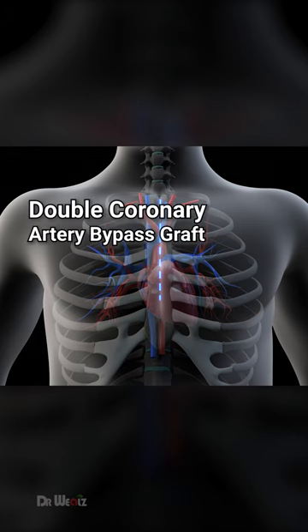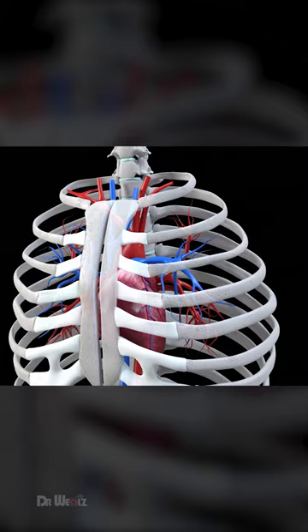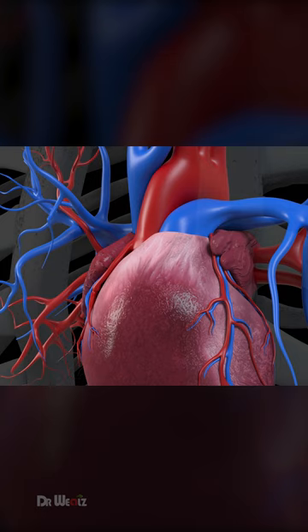Double coronary artery bypass graft is a surgical intervention performed to restore blood flow to the heart when two coronary arteries are severely blocked, typically due to atherosclerosis. During the procedure, the patient is connected to a heart-lung machine, temporarily taking over the heart's pumping function.